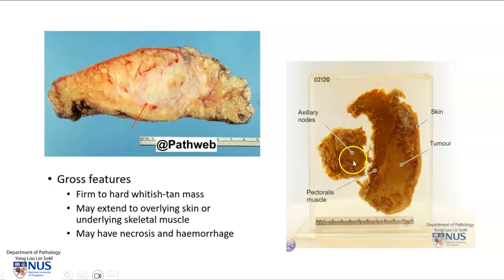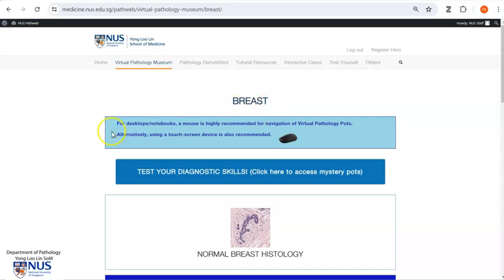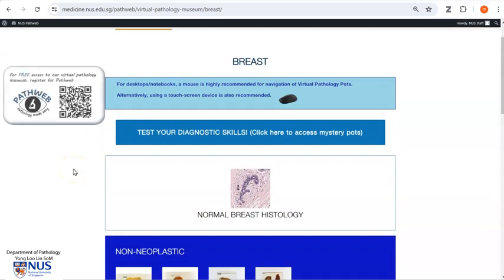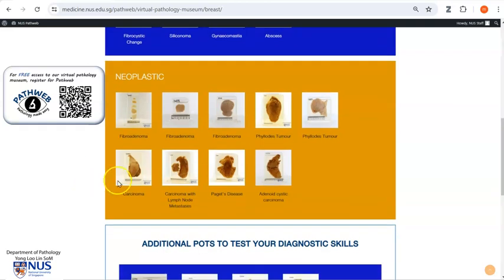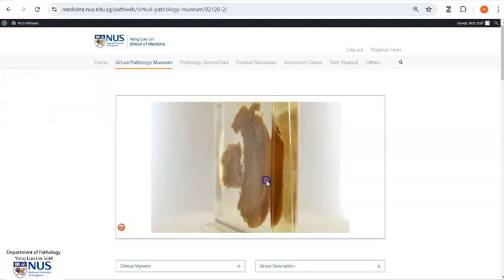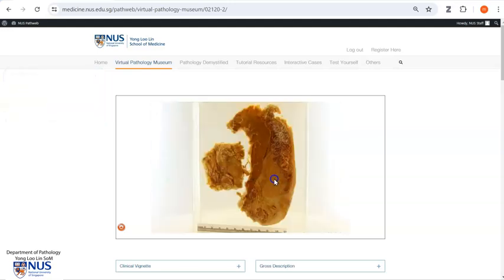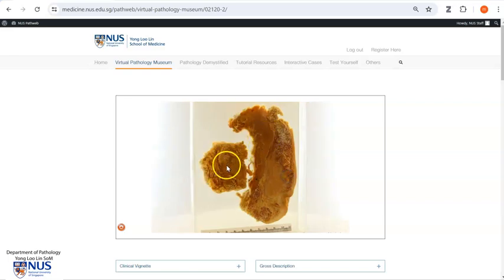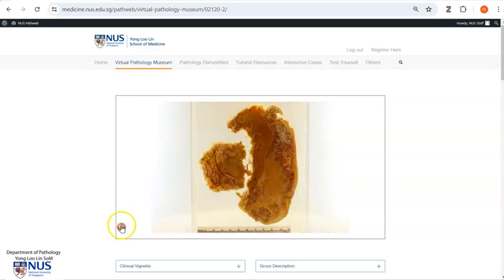We also have here axillary lymph nodes which appear fleshy and enlarged, and these are involved by metastatic carcinoma. Here is the breast chapter in PathWeb in our virtual pathology museum, and I'm going to select a case with carcinoma with lymph node metastases. This is the same gross pathology virtual specimen that we saw earlier, with the skin and the tumor, pectoralis major muscle, and the nodal metastases.